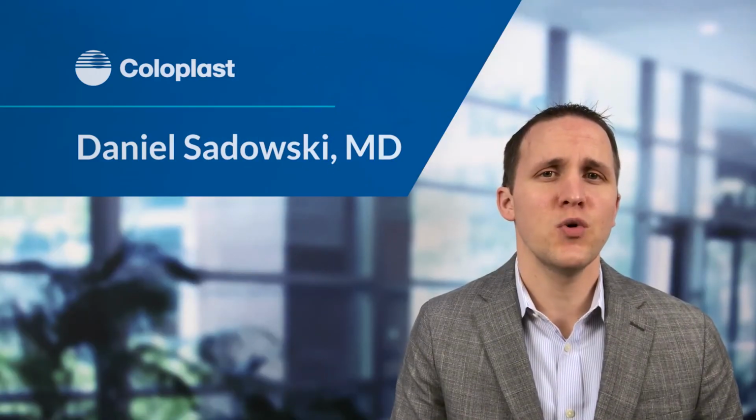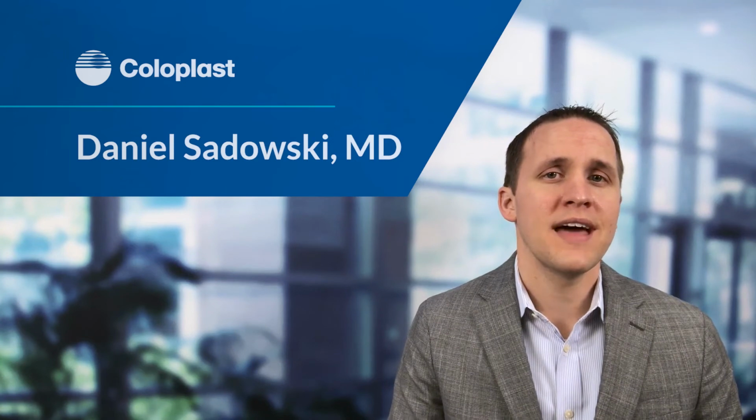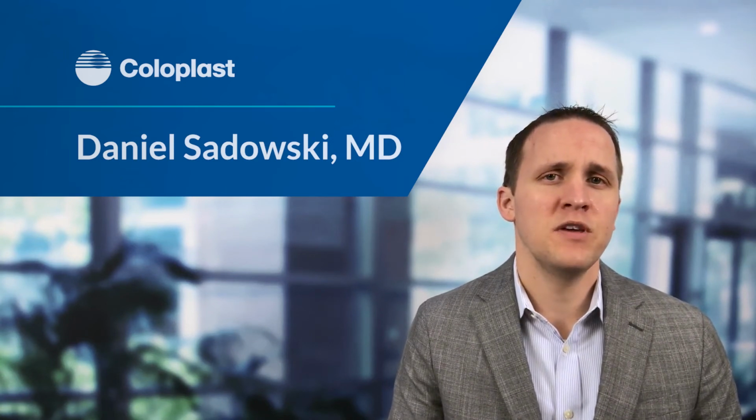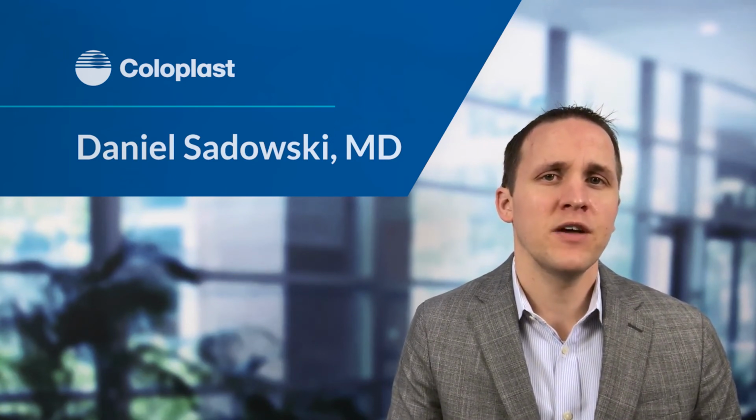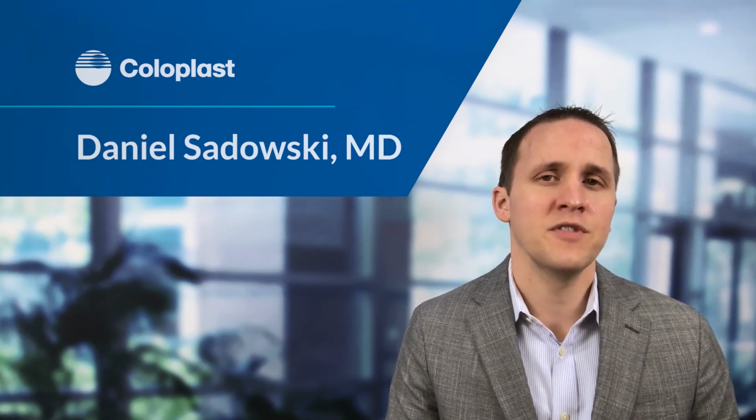So studies have shown that at 10 years, 80% of implants are still functional. Or that, put another way, 20% of people will have some failure of the device in the first 10 years after the implantation.